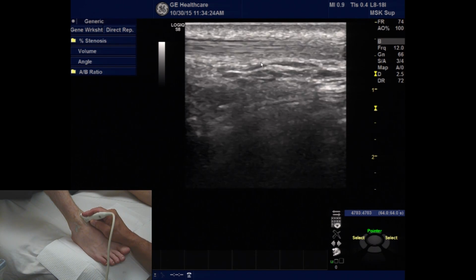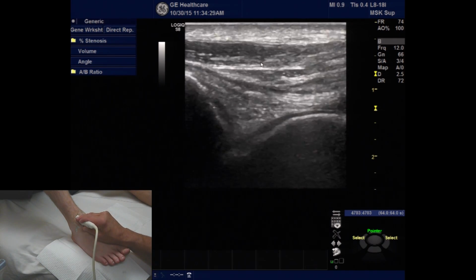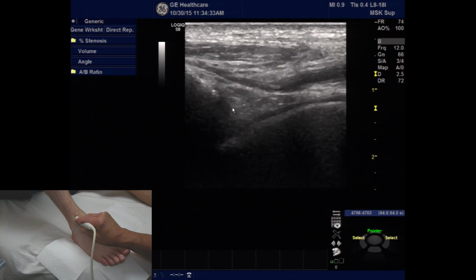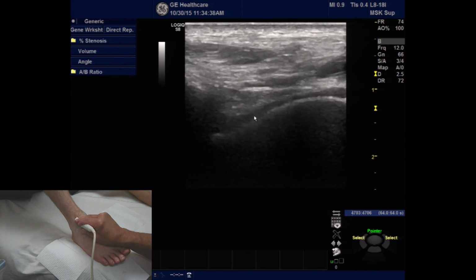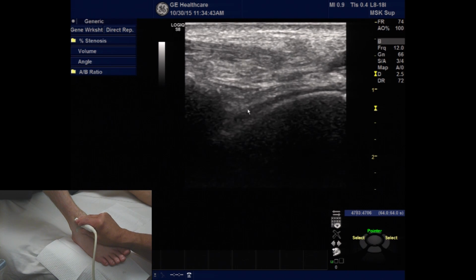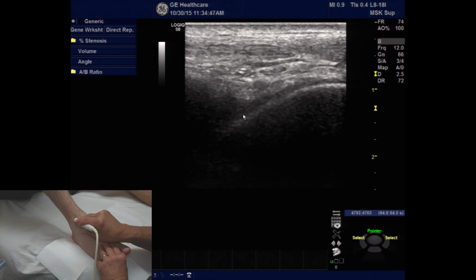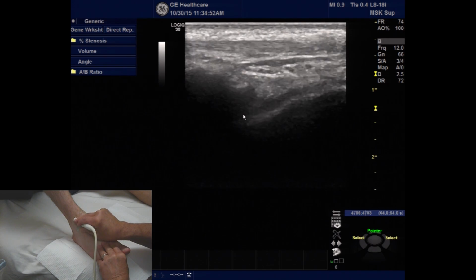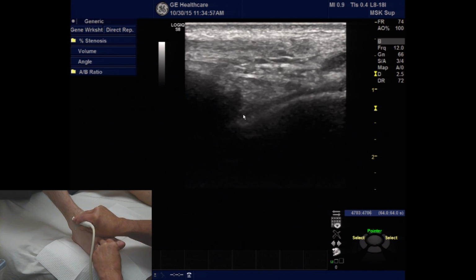The last aspect that we're going to look at on the anterior ankle is as we move the transducer over more towards the fibula, we're going to see once again the talus and the tibia. And deep to that is going to be a recess known commonly as the lateral gutter. This is a common area for soft tissue impingement, and to test for it, we would dorsiflex the foot and look for any kind of loose bodies or impingement of the two bone structures in the joint space as they move across each other.